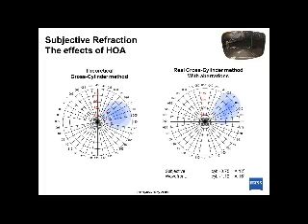Again, here the patient would not see a difference. So then, again, this is very simplified. The doctor would go to the cross-cylinder method and start checking the cylinder power. And this would be 1 or 2. You see that 2 is actually right in the very center of the best vision for the patient, so they would pick that spot. Again, the doctor would go 1 or 2. The patient can't see a difference. So the sweet spot then would be there at the point that says C. So that would be a simple lens that just has sphere and cylinder aberration, just the lower order aberrations.